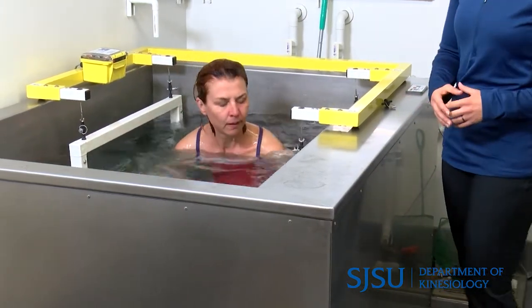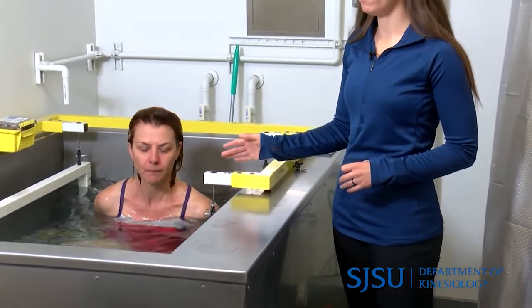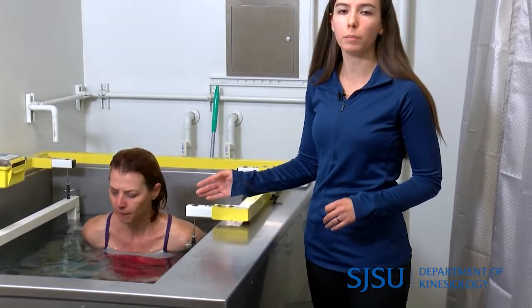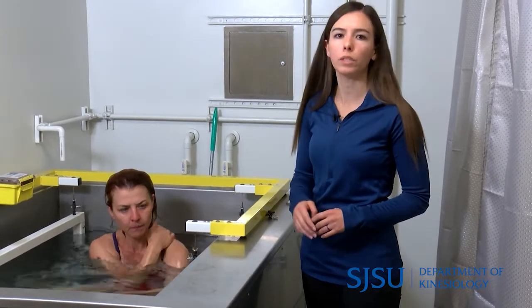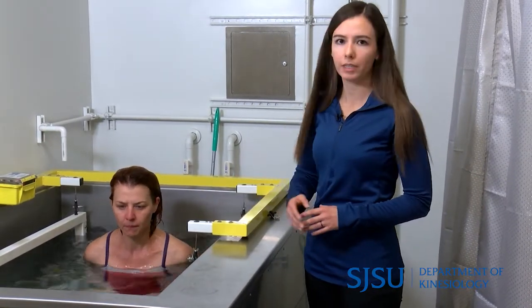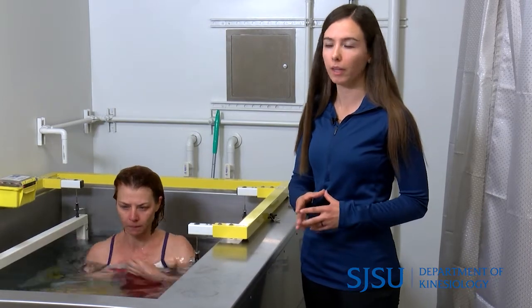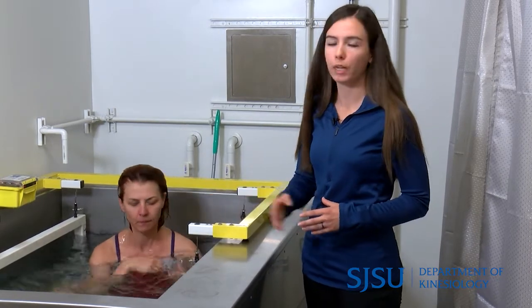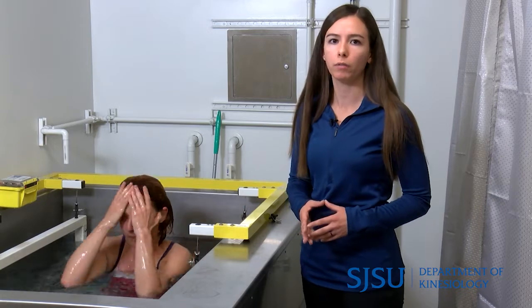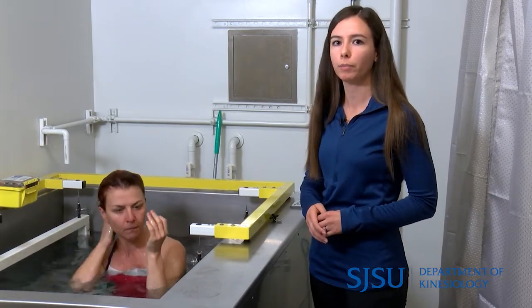The reason we have Alev sit directly on the platform rather than stand is because the platform can only support fifteen pounds of weight — we wouldn't want it to snap off. It's really important that when you use this hydrostatic weighing tank, you step directly onto the metal floor and then gently sit yourself down onto the platform.